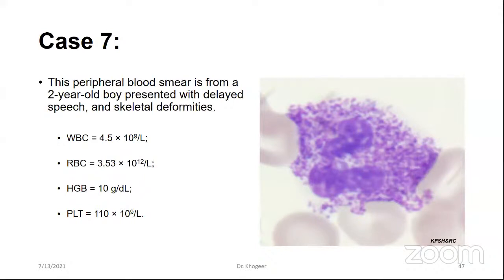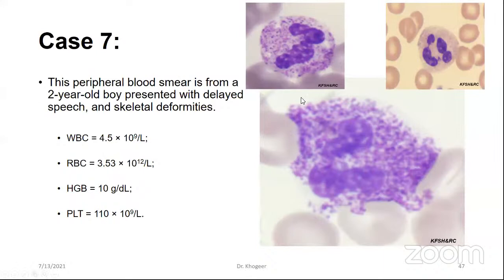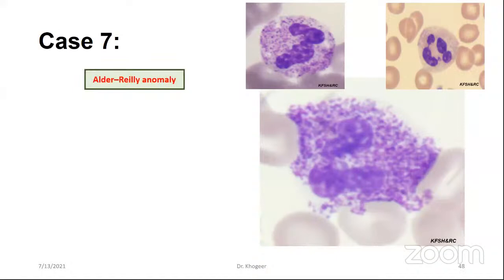That's true, in the cytoplasm of the neutrophils. If we compare it with the normal neutrophils, and this is neutrophils showing toxic changes, it's more coarse and more dark.